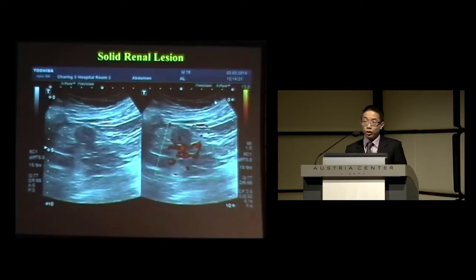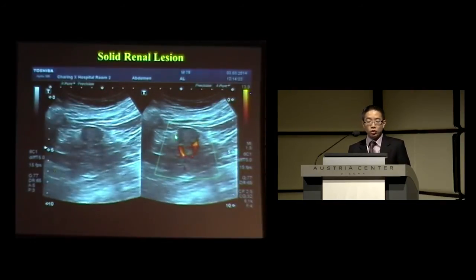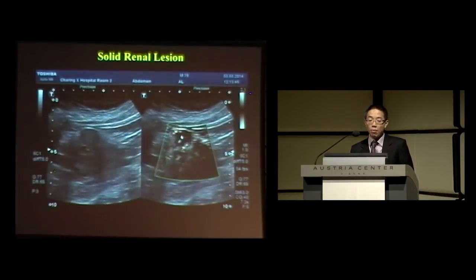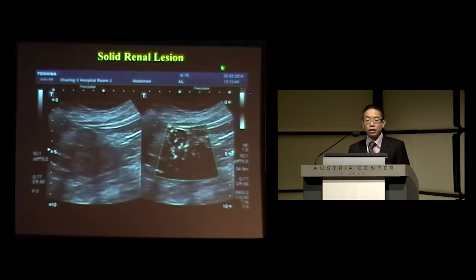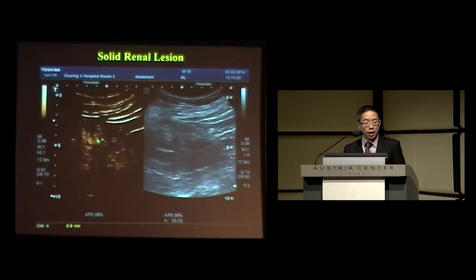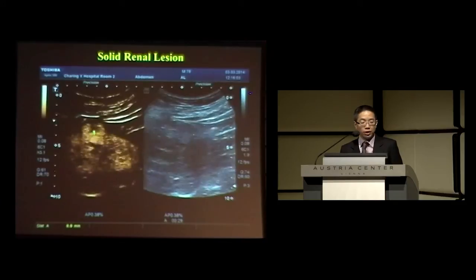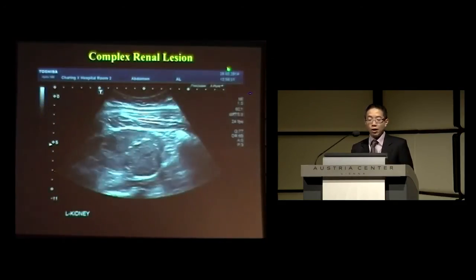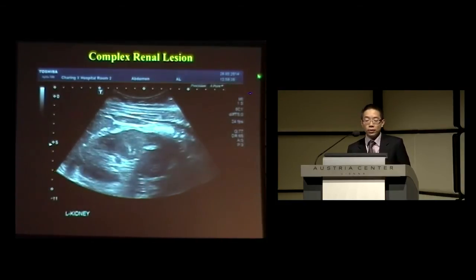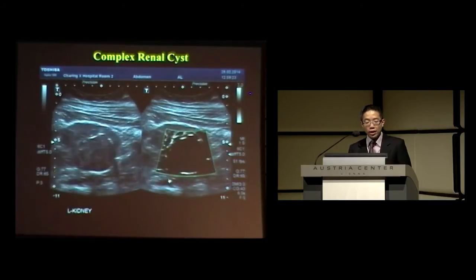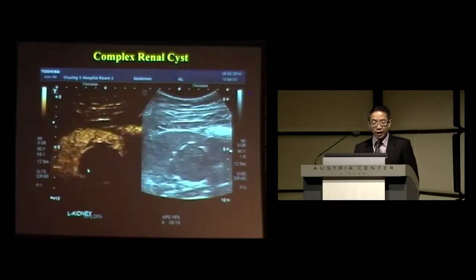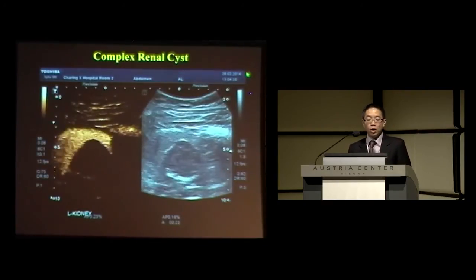For a solid renal lesion where you want to know whether it is vascular — here is a renal lesion with no vascularity seen on Power Doppler, but when you turn on SMI you get marked vascularity within the lesion. Contrast confirmed a hypervascular enhancing lesion with an area of necrosis — renal cell carcinoma. In contrast, another apparent solid renal lesion with a slight calcified rim shows no flow on SMI at all. Contrast confirmed an enhancing kidney but absolutely no flow within the lesion itself — an avascular, non-malignant lesion.